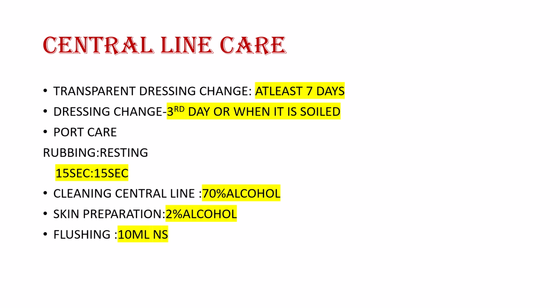Then what is port care? In port care, there is rubbing and resting. We have to rub for 15 seconds and rest for 15 seconds. For port care cleaning, we have to clean it with 70% alcohol, and for skin preparation, we have to prepare the skin with 2% alcohol. Then flushing. After every medication administration, we have to flush it with 10 ml of normal saline.